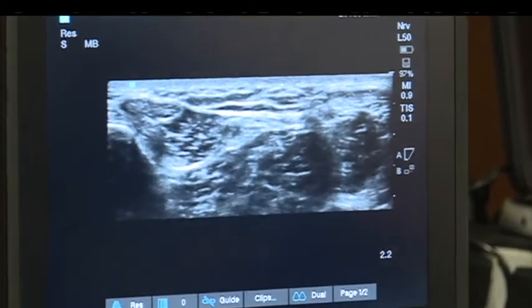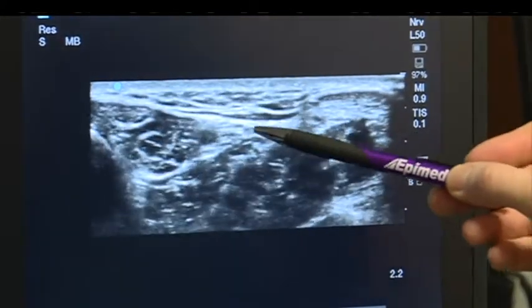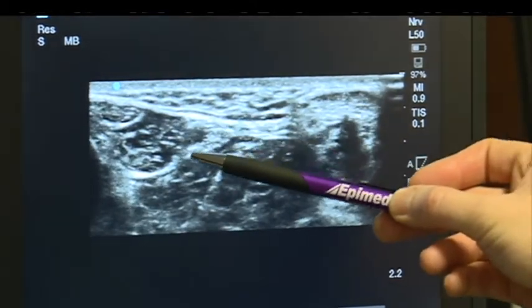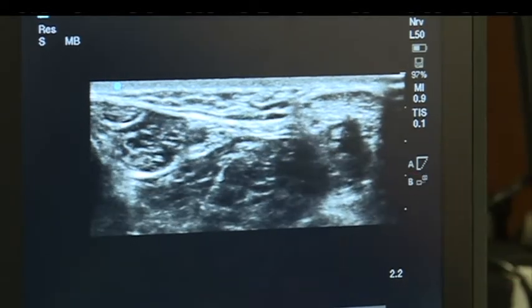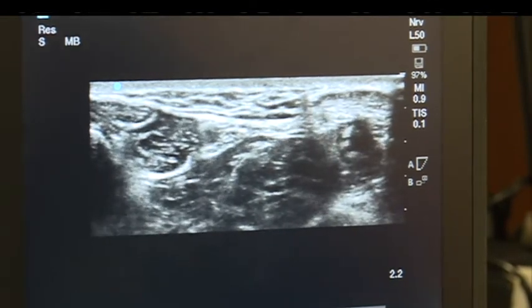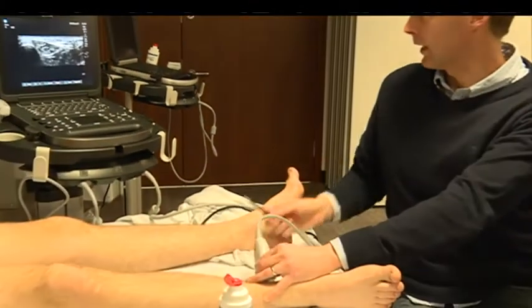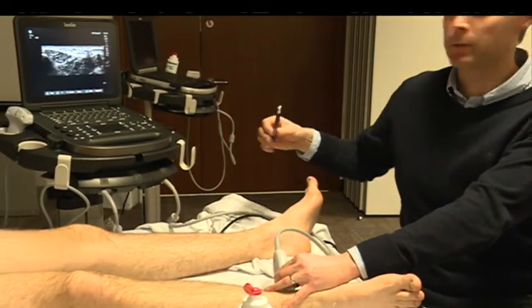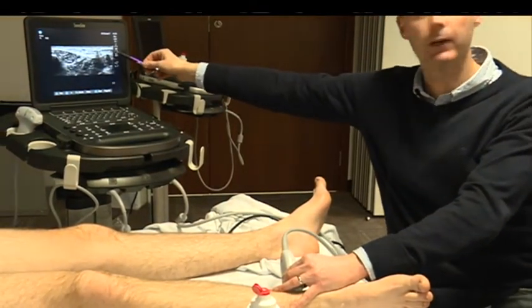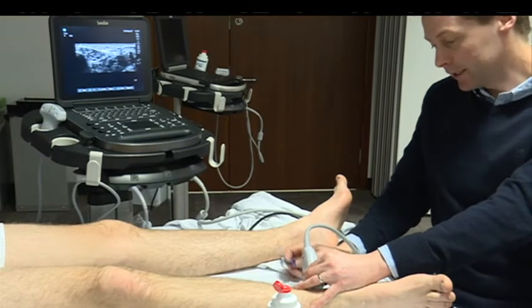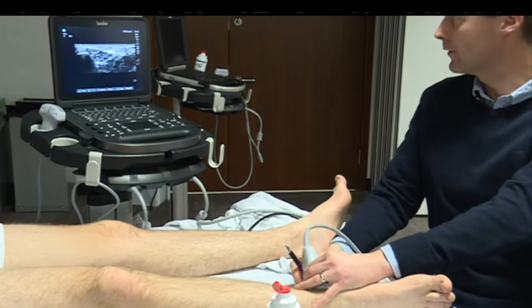The tibial nerve lies immediately posterior to the artery. You can see it here, just hooking underneath the artery a little bit. In terms of needling, we tend to needle from posterior, but the problem is getting in over the Achilles. If scanning here I get a lovely picture but can't needle because the needle would be coming through the Achilles — no patient thanks you for that.